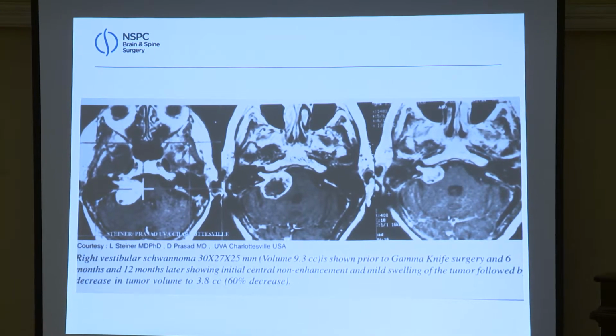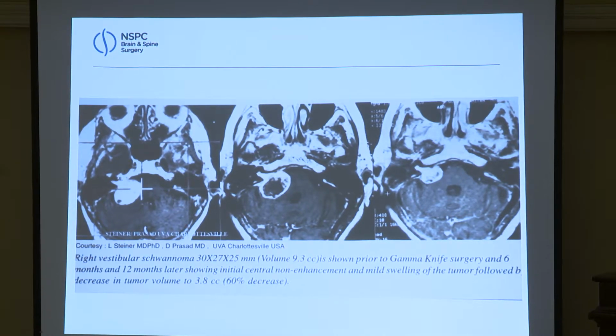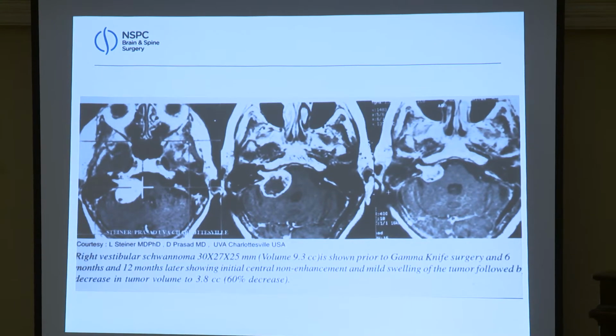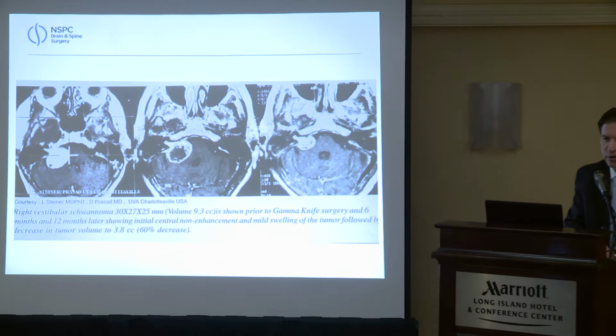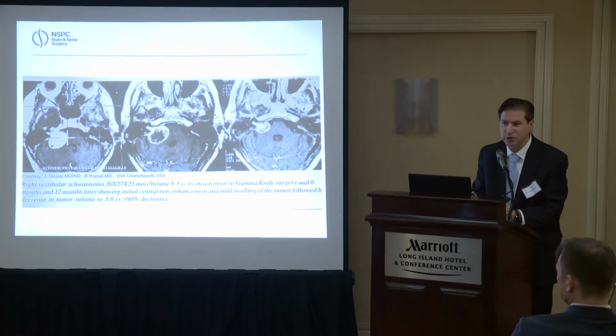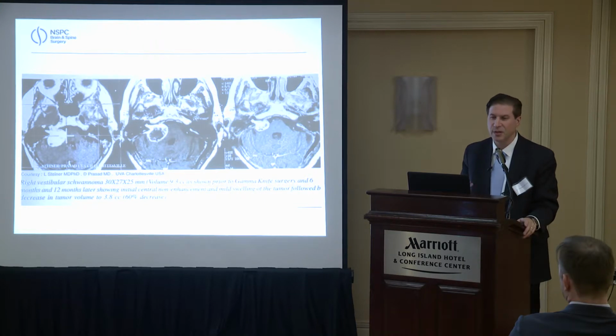Well, no, of course you don't want cancer, but the chance of you getting cancer from Gamma Knife might be 1 in 100,000, it's a minuscule amount. And so the likelihood you're going to die of cancer from Gamma Knife or an acoustic is minuscule, whereas the chance that you're going to die from a brain operation is like 1 in 100. There's a real chance of something seriously bad happening.